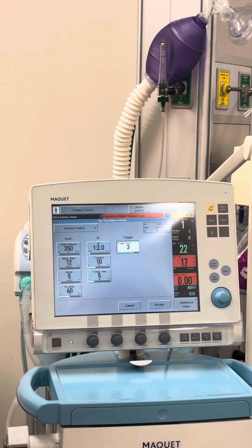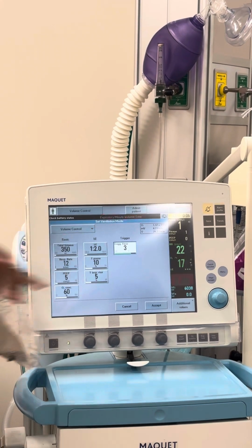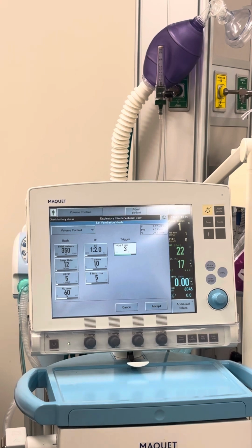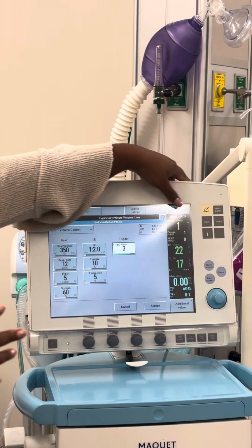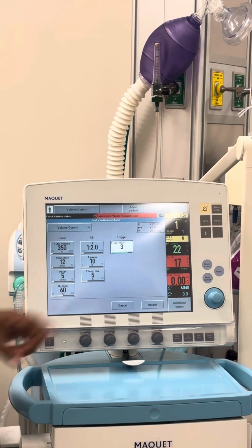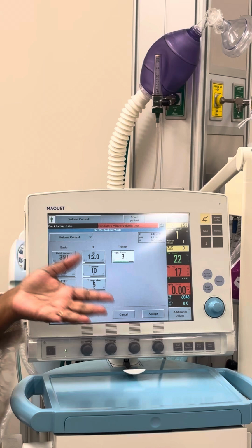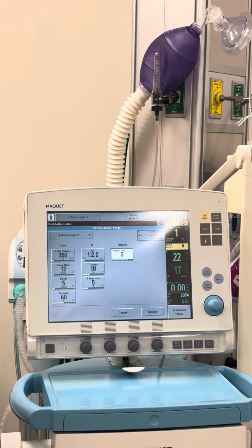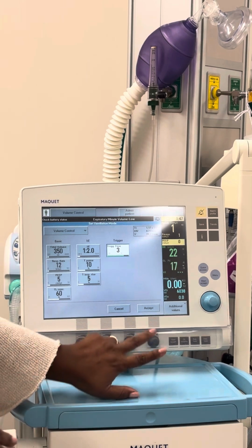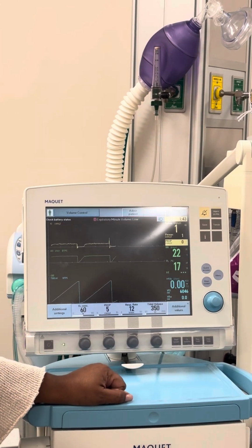And then you can adjust your IE ratio. You can set it here, but you can actually adjust it by your frequency or your respiratory rate and your flow rate. Here you can't, because you don't have that flow rate to adjust it with. So you only have to adjust it this way, and you can actually force them to have a certain IE ratio. All right, make sense? Yes. So what am I going to do? Always do what Ms. Temple said. Accept. And then there you go.